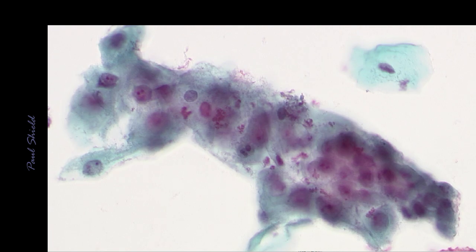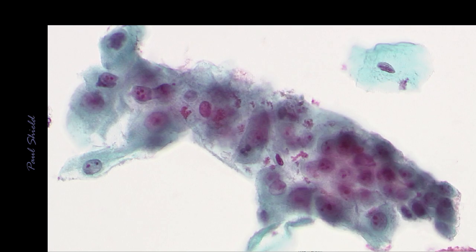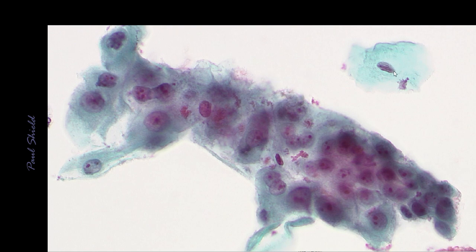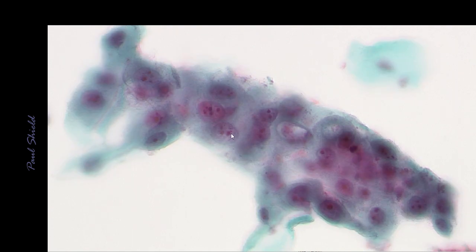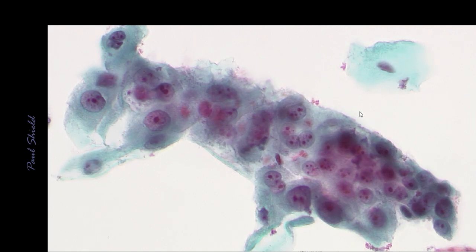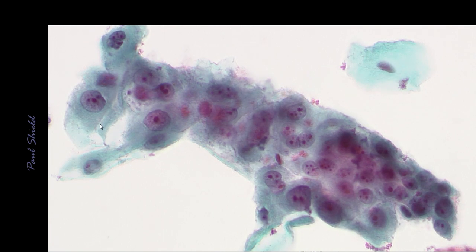So I'm focusing up and down slightly here. You can see there's at most 2 nuclei deep. The nuclei are quite enlarged compared to the intermediate cell on the top right there, but very bland chromatin again, so it's very even, fine chromatin. Nucleoli, sometimes multiple in all cells, a nice round, smooth nuclear membrane, very little nuclear overlapping, so once again quite a low NC ratio to these cells, and they're very cohesive.